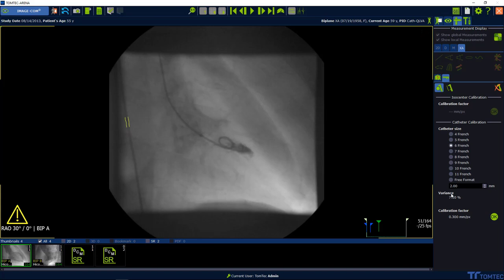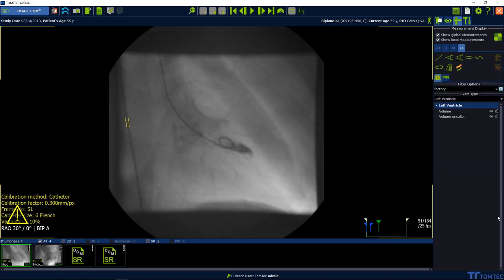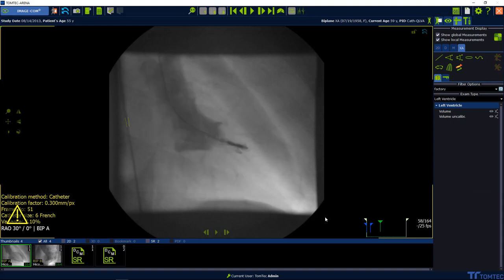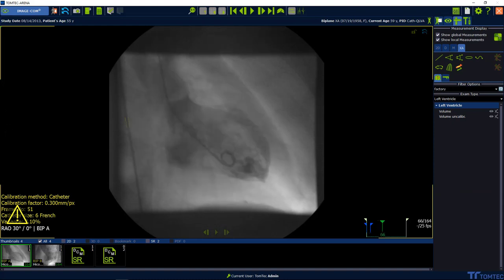You can also go frame by frame to see a better image. The size of the catheter will be automatically detected. Select OK to confirm the proposal. Please be aware the variance must be lower than 8%.